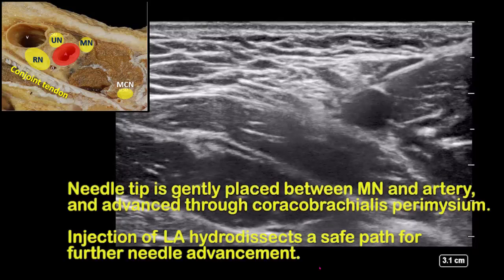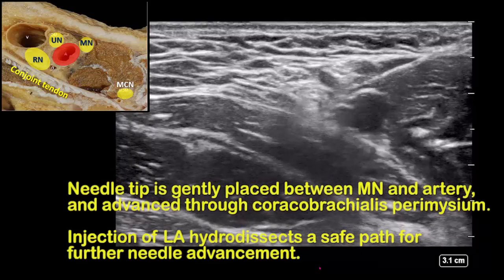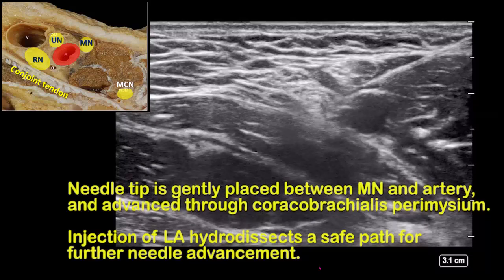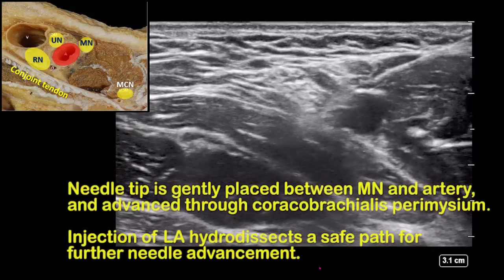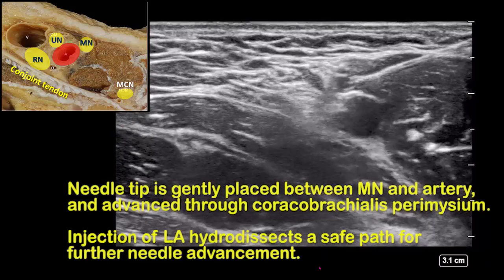Advance towards the median nerve. Depending on its position relative to the artery, aim to pass either superficial to the nerve, or as in this case, between the nerve and the artery. Inject half-mil boluses of local anesthetic to hydrodissect a safe path between nerve and artery.